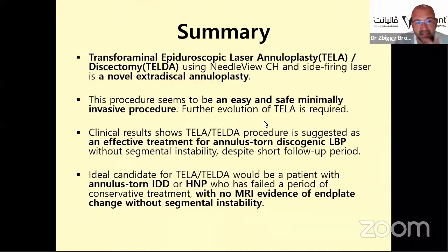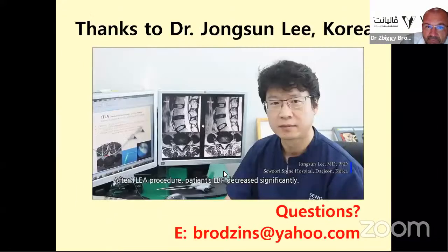Also interlaminar approach was performed for this patient. So in summary, this transforaminal epiduroscopy laser annuloplasty is a new extradiscal annuloplasty. We are not performing anything intradiscal like for IDET, for instance. It's a very minimally invasive, safe procedure in local anesthesia and very superficial IV sedation. If you additionally have MRI evidence of endplate change, you can also perform basivertebral nerve denervation, so you can combine discogenic and vertebrogenic back pain.